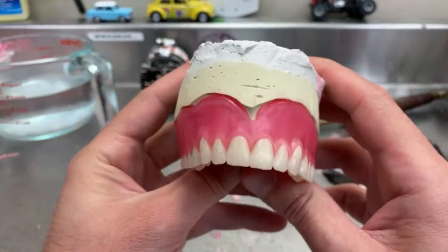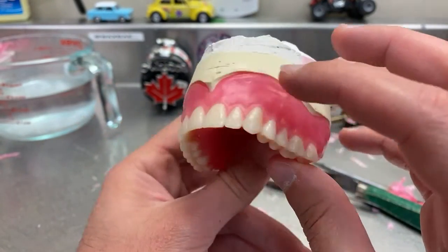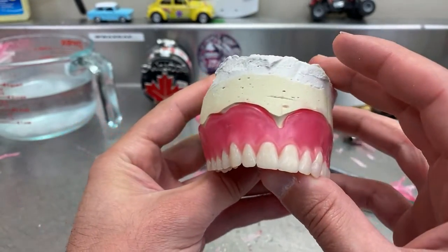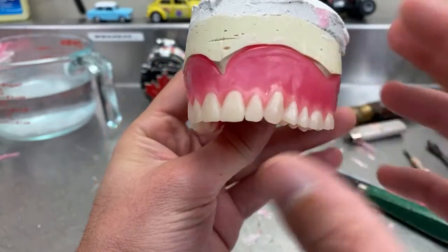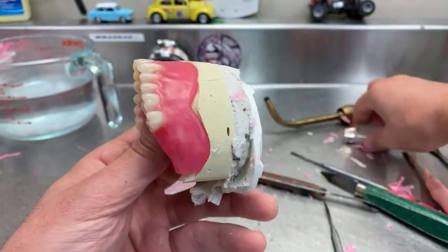So you see here how all these marks that used to be here are gone, and also maintain those rolls as I'm working on it. Needs a little bit of flames here.